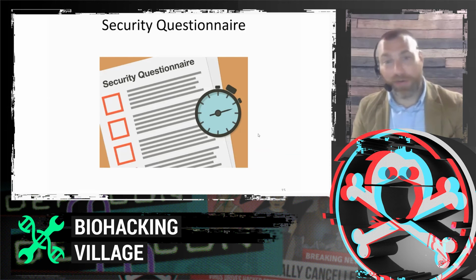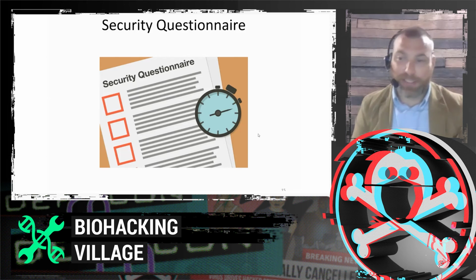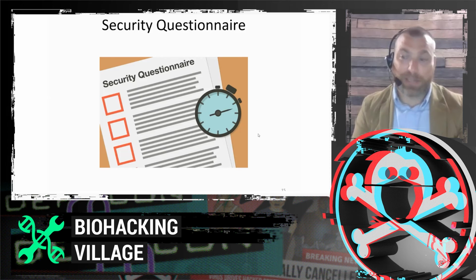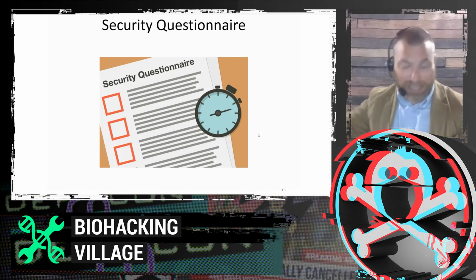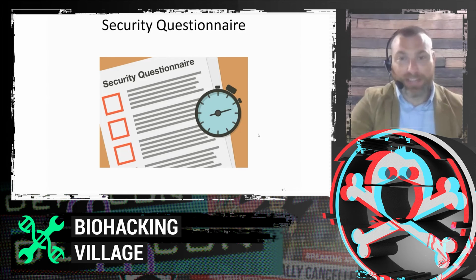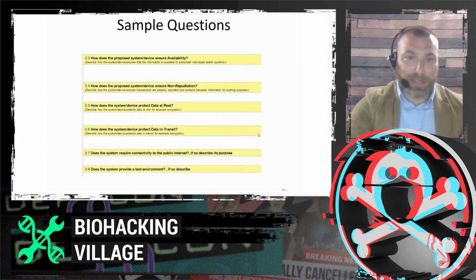If you're tasked with creating one of these, try to create one in a good format that allows manufacturers to go through and check off or uncheck things that aren't applicable. So if it's not a cloud product, you can click no, not a cloud product, and it automatically fills in NA to the next 150 questions, and the manufacturer doesn't have to click NA and then put in a comment for each as to why it's not applicable. That would be great.